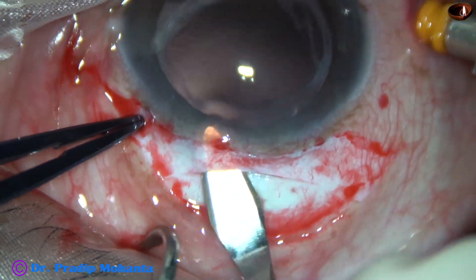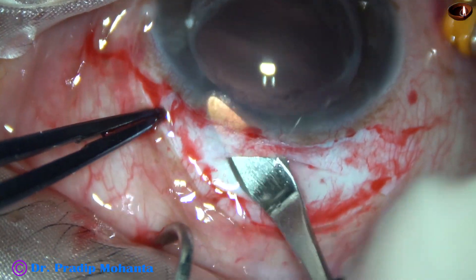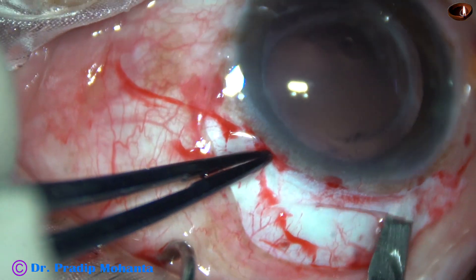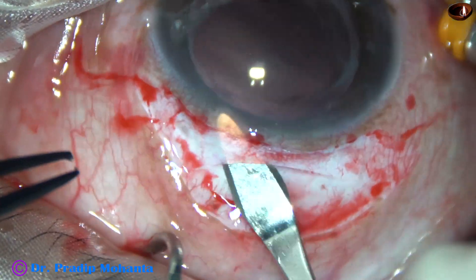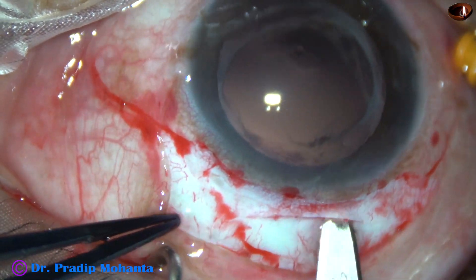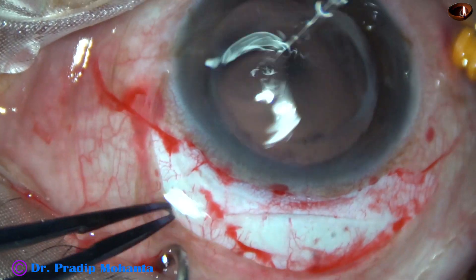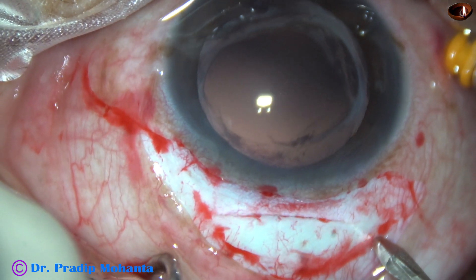We can see a good rim of anterior capsule in this case. The previous surgery was done elsewhere, and the patient has come to me after the intraocular lens dropped about a month back. After making the sclerocorneal tunnel, I made two sclerotomies.